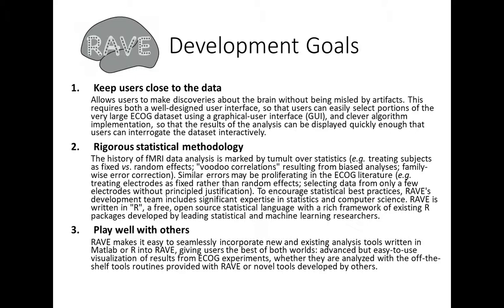Second, we want to have rigorous statistical methodology. Again, by analogy with fMRI, there's been periodic paroxysms of controversy in fMRI. For instance, in the early days, subjects were treated as fixed effects, when it eventually became clear that really no, subjects were not all identical. They needed to be treated as random effects, and many other kinds of statistical arguments.